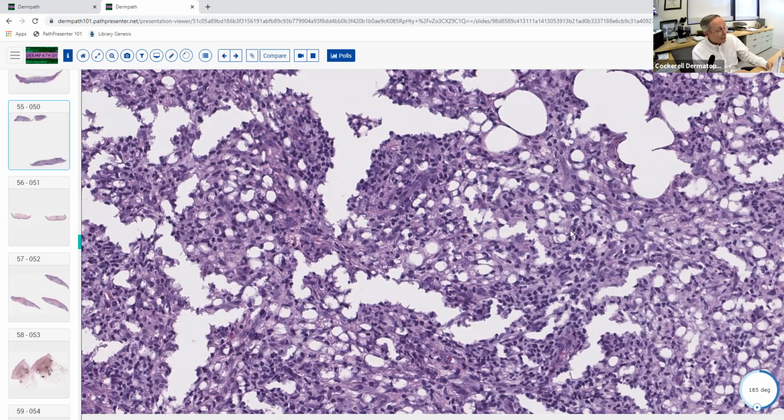It's even as far north as Dallas. So, a 30-year-old woman from southeastern Texas, that's an endemic area, comes in with a nodule on her cheek. That's a good location, an exposed area where the fly bites. Eruptive xanthoma, we've already seen one of those. Clearly the answer to that is no. Leishmaniasis, the answer is yes.